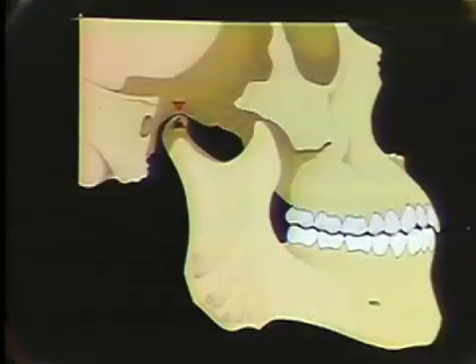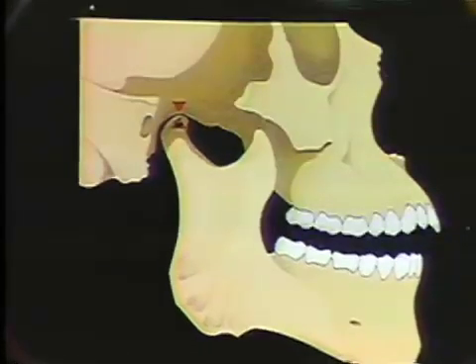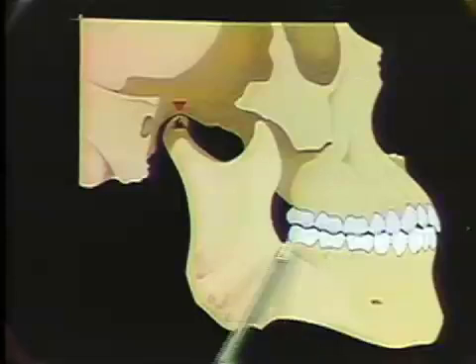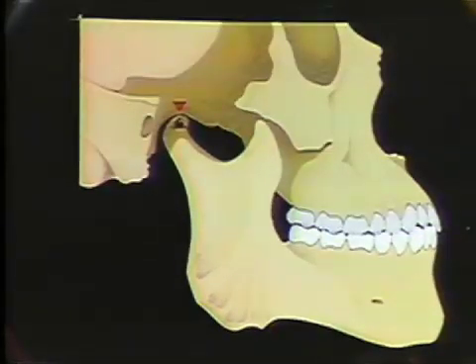In order to understand the problems involved, it's necessary to examine the stresses which fall on the teeth and see just how these transmit themselves to a bridge retainer. If we take a look at the diagram here, we can see how when the mandible opens and closes, and the teeth come together and meet in centric occlusion, stresses are brought to bear on the occlusal surface of all of these teeth. If we now move to the larger diagram, we can examine the exact nature of those stresses as they affect individual teeth.